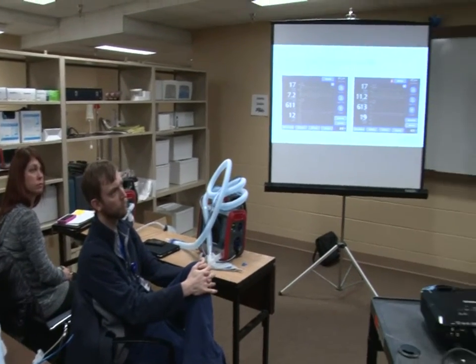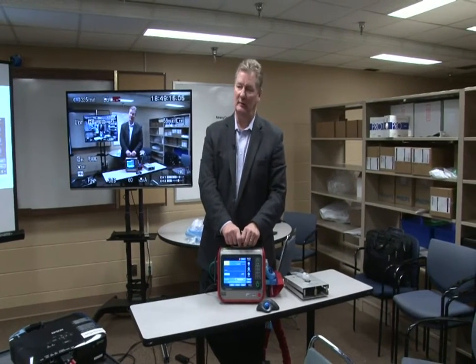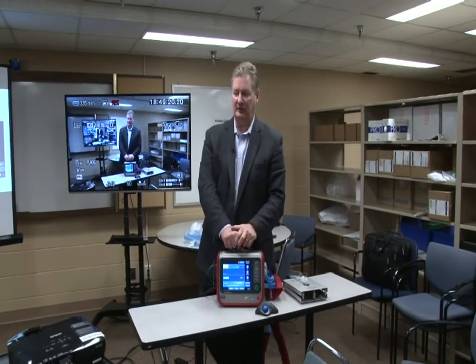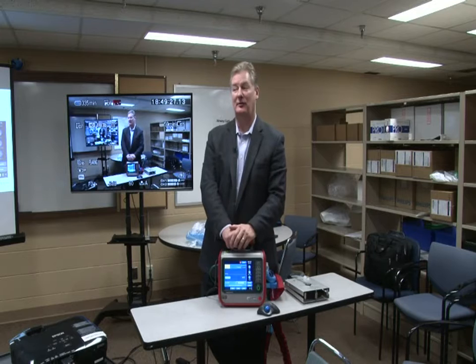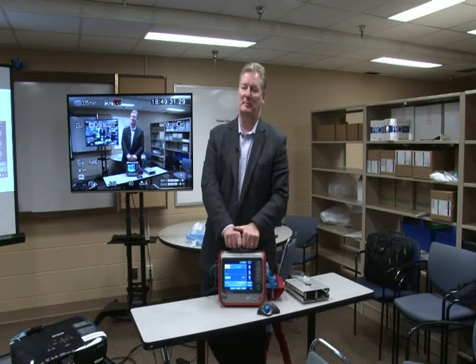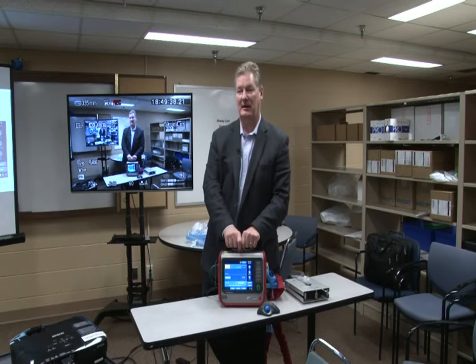I agree completely with that. The side note is don't be alarmed. It probably won't happen all the time. Hopefully it will never happen, but most likely it will. You'll go to a referral facility and ask what their exhaled minute volume, their PEEP and their FiO2 are, and you dial that in and you get very different settings. That's because, arguably, the patient was not on the best possible settings to begin with, like the woman I was telling you about in Grand Rapids at a hospital that shall be nameless.